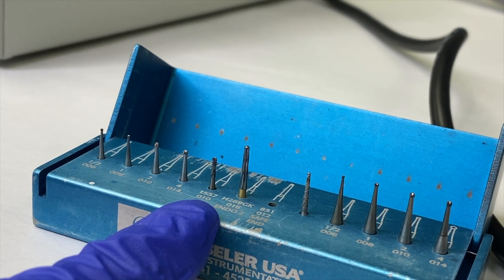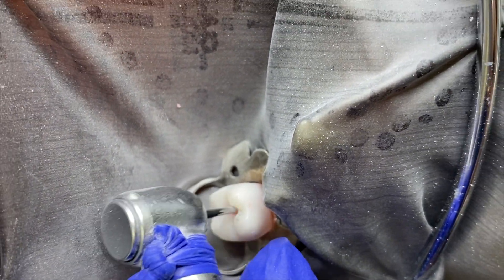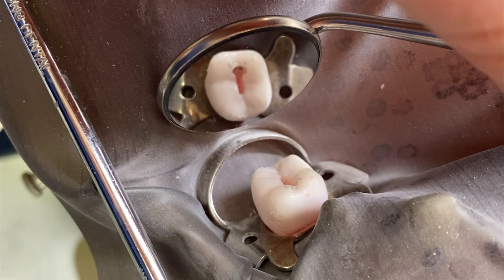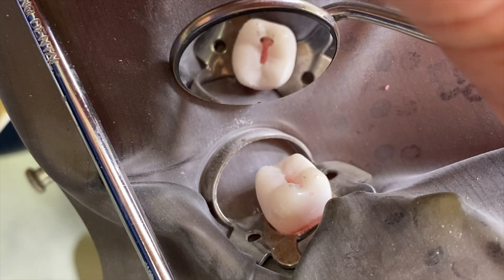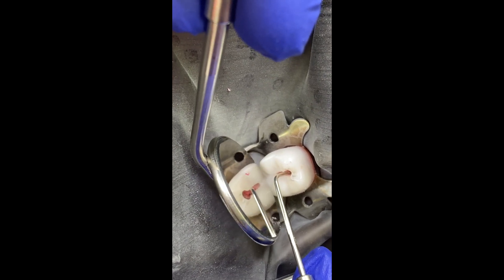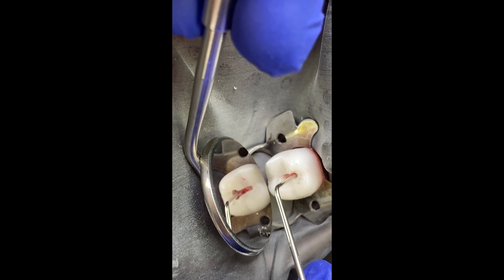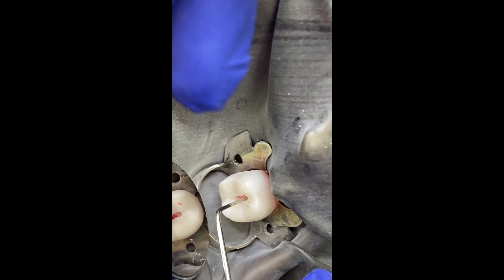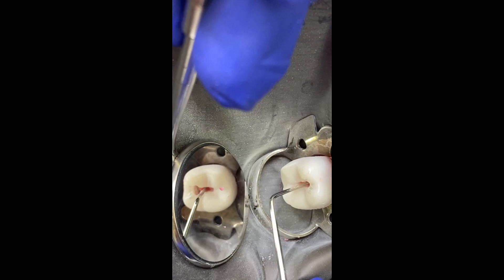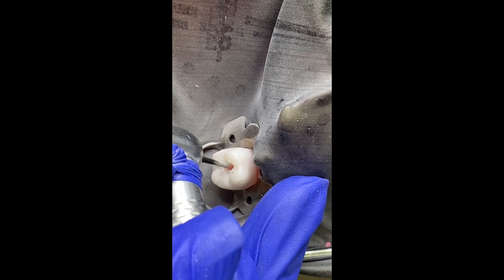Now we are going to use the endo Z burr. This is a good safe burr to open up your initial access. Keep in mind that there are three layers of the tooth, and each layer has a different tactile sensation, with the pulp feeling a little like mush. It's easy to mistakenly think that you have overextended. However, you want to keep in mind that there is a ledge here that you have to remove in order to have straight-line access. Once you remove that ledge, your burr won't appear to be two millimeters over from where your access point was. Now I'm starting to remove the roof of my pulp chamber to convert my initial T shape into a more trapezoidal shape.